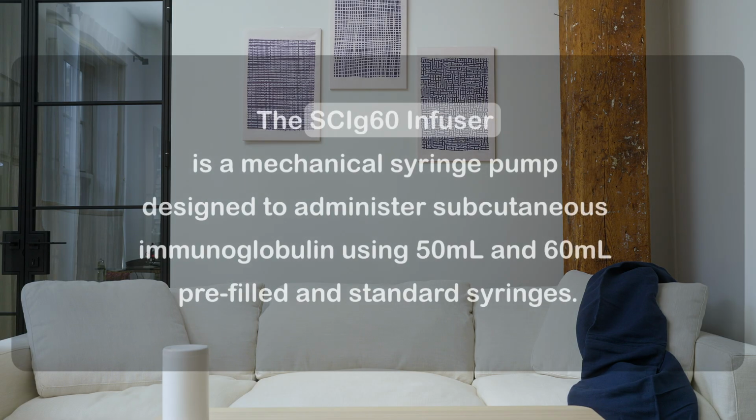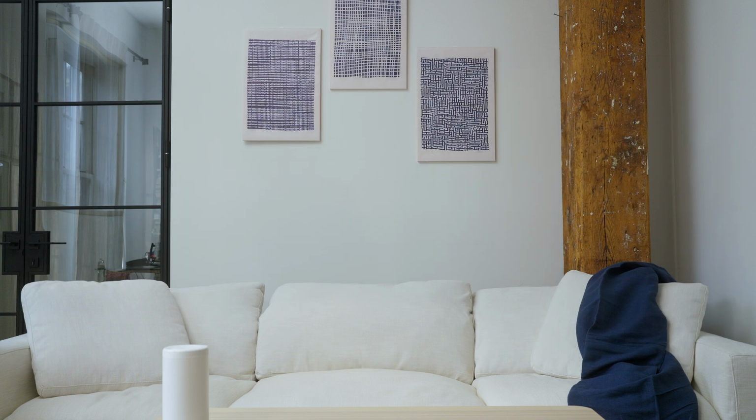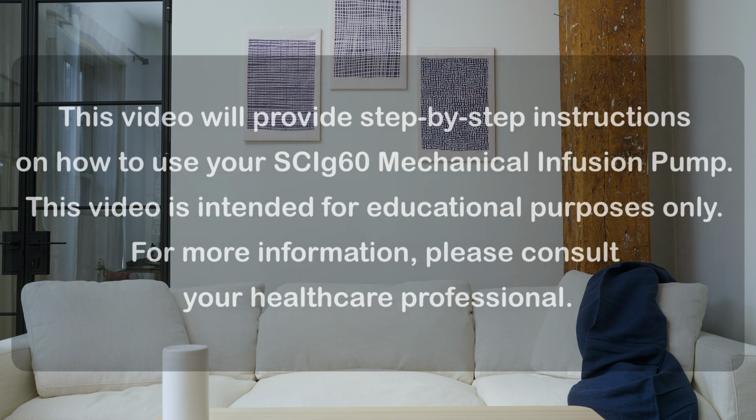The SCIg60 infuser is a mechanical syringe pump designed to administer subcutaneous immunoglobulin using 50 milliliter and 60 milliliter pre-filled and standard syringes. This video will provide step-by-step instructions on how to use your SCIg60 mechanical infusion pump and is intended for educational purposes only. For more information, please consult your healthcare professional.